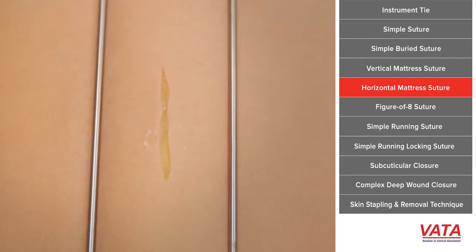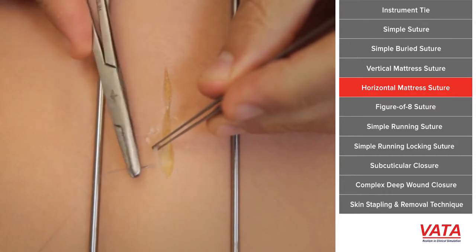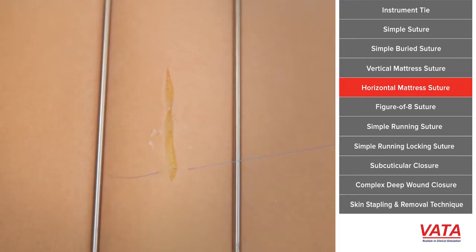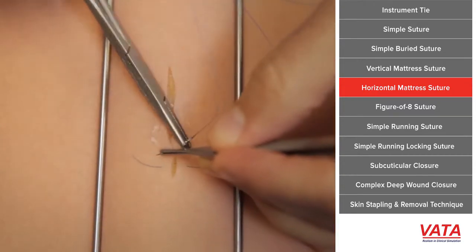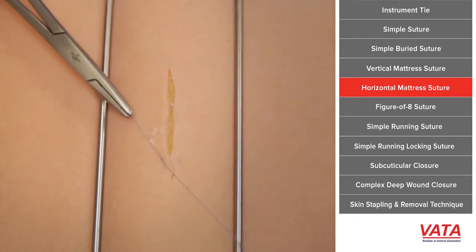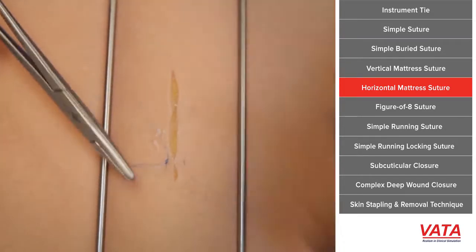What you'll do is enter the skin as if you would for a simple suture, and instead of tying it as a simple suture, turn your needle around, move the same distance you would for a simple suture, and enter it the same way — almost like doing a simple suture on the other side. This is still a mattress suture because there are two different rows of suturing, but now instead of a vertical line it's in a horizontal line. Pull together only until the edges kiss each other. It has the advantage of being faster than two simple sutures.